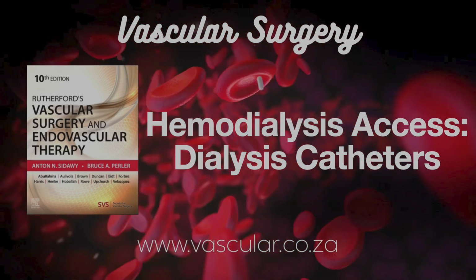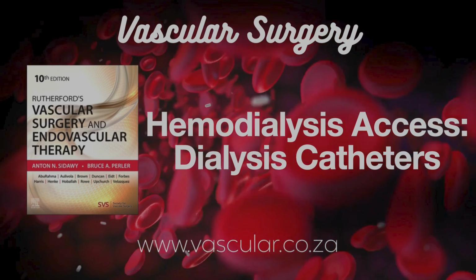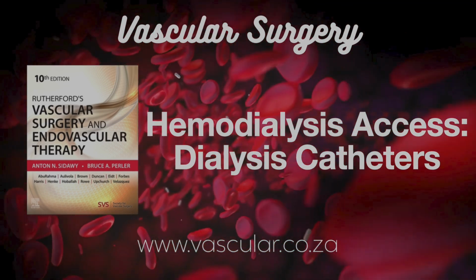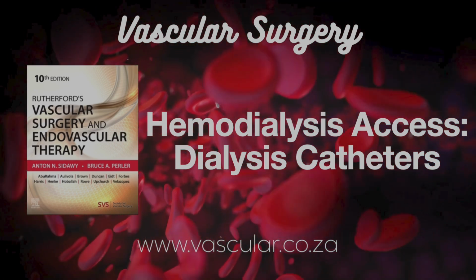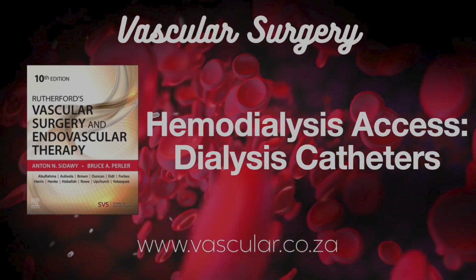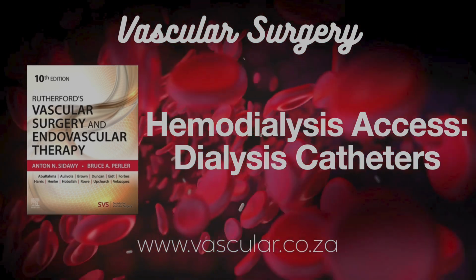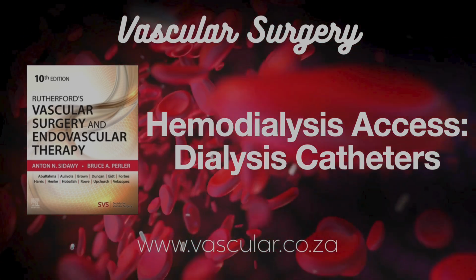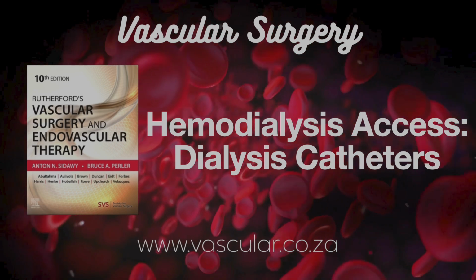Well, there are sort of four main design categories aimed at getting that high flow and keeping recirculation low. Okay, what are they? First, you've got the split tip design. It's a double lumen catheter, one body, but right at the very end, the tip splits into two separate ends. They often have side holes, too, to help with flow. Physically separating the outflow and inflow points. That's the idea. Then there's the step tip, or sometimes called a staggered tip. Again, double lumen, single body. But here, the venous limb returning blood is longer than the arterial limb drawing blood out, usually by at least 2.5 centimeters. So creating distance between the two points, again, just in a different way.